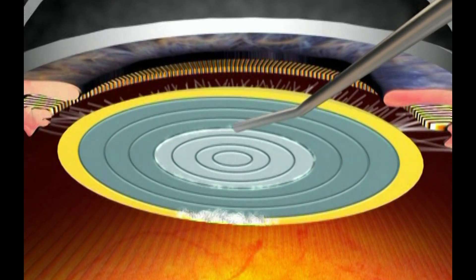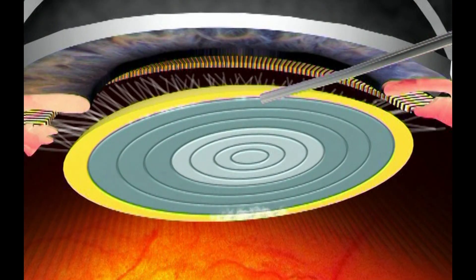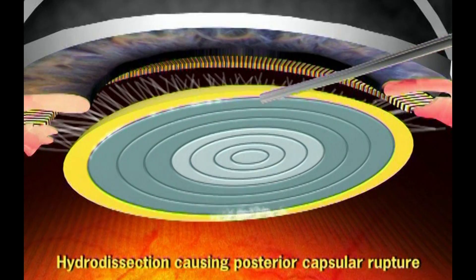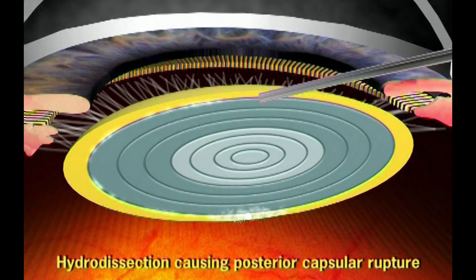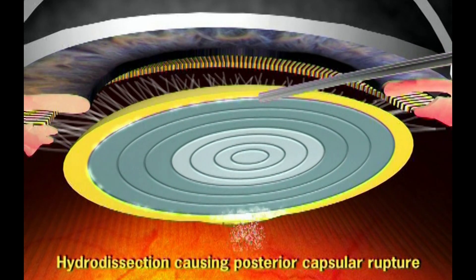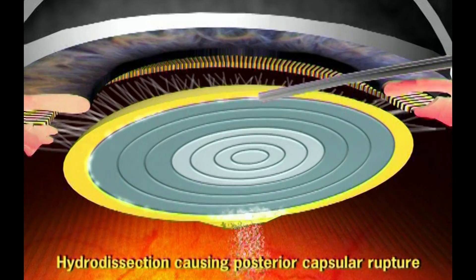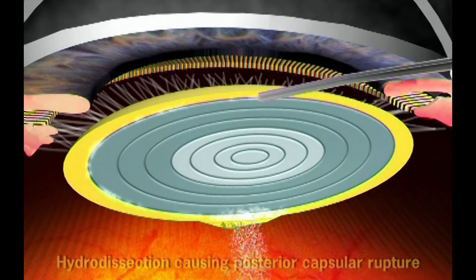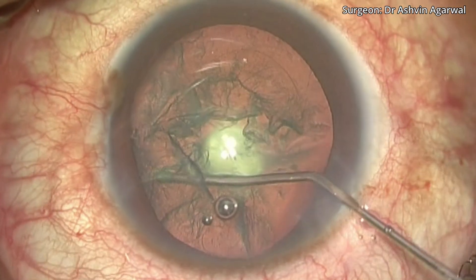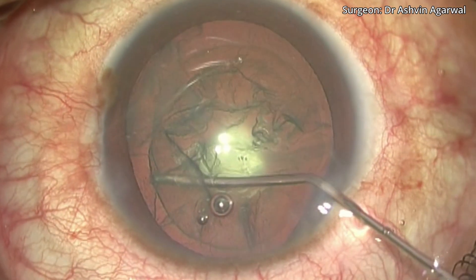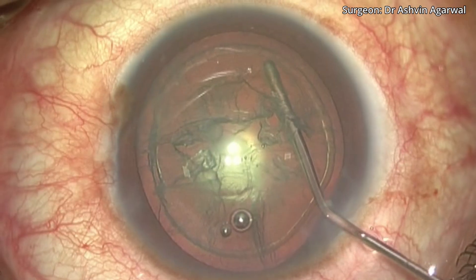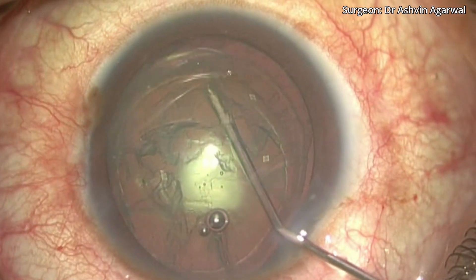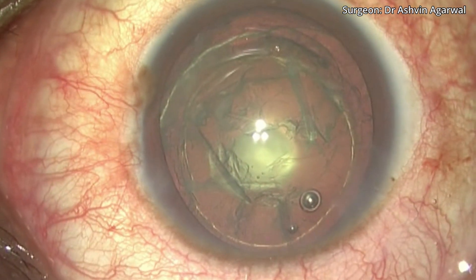Hydrodelineation is then done. Hydrodissection should be avoided in PPC because the hydraulic pressure from the fluid injection can cause a posterior capsular rupture, due to the adhesions between the PPC and the posterior capsule and a thin posterior capsule over this particular area.